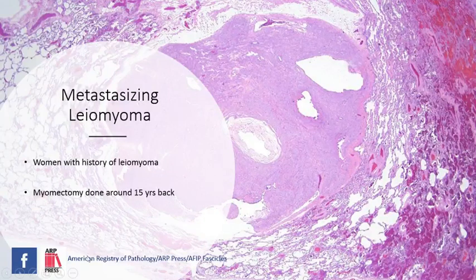If you go to this ARP press page in Facebook, they have also provided the IHC markers. You can distinguish the lung. Then they have done the IHC for leiomyoma, etc. But I am not posting any IHC pictures, just the histology.